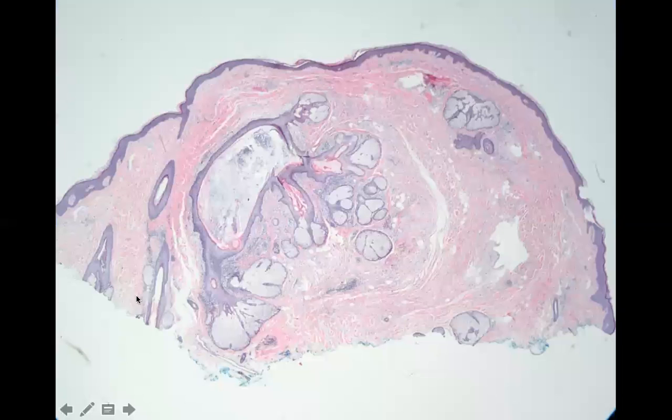So as you can see, this would be normal hair follicle, normal collagen, and here you've basically taken this little area and blown it up like a balloon. And it looks a little bit exaggerated and caricaturized, but your follicle is really dilated, but otherwise it looks fairly normal. Your sebaceous lobules are dilated and there's too many of them, but they come off in ways that resemble normal. You can even see here there's a split in your stroma, and your collagen is also overdeveloped alongside the follicle, and you have all these little white spaces. You might have a little bit of fat, you might have a little bit of extra blood vessels. So it's basically like you took a section of skin and you blew it up and made it a little funny looking. That's my very technical definition for a hamartoma.